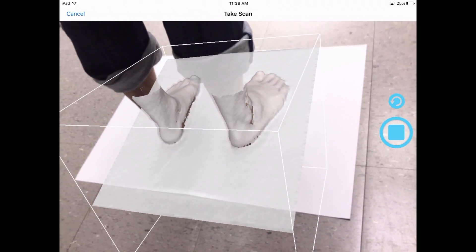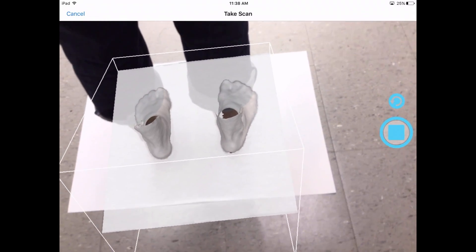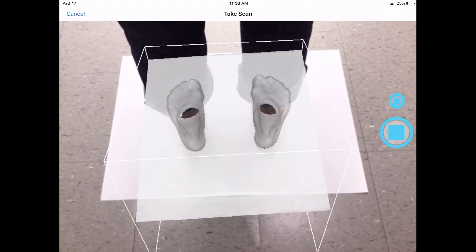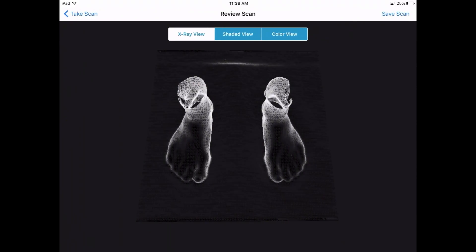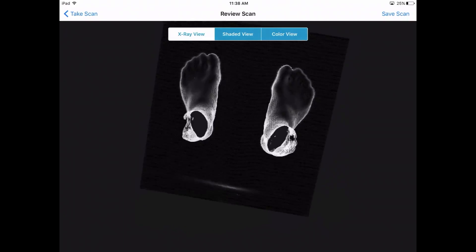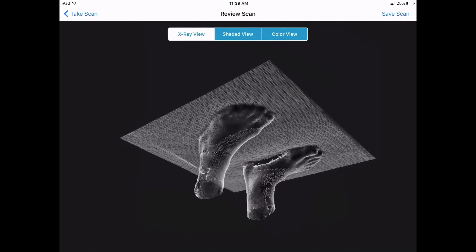Once both feet are completely highlighted in white, you can then press stop. You don't need to return back to the start position — you can press stop from behind the feet. Carefully check over your scan and make sure you're not missing any data in the scan. That concludes a full weight-bearing scan.